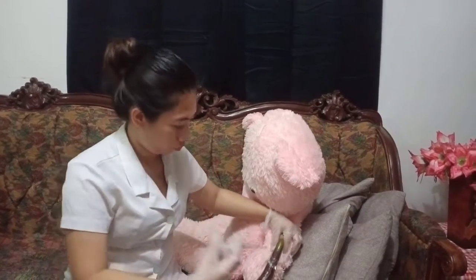So, holding the syringe with the thumb and forefinger, insert the needle through the skin quickly and smoothly at a 90 degree angle.